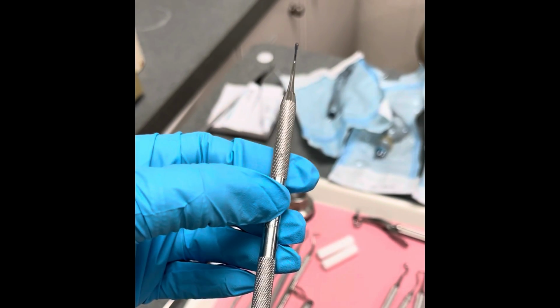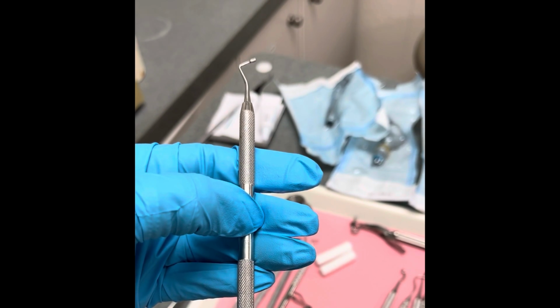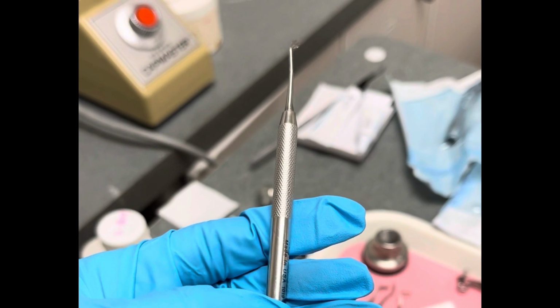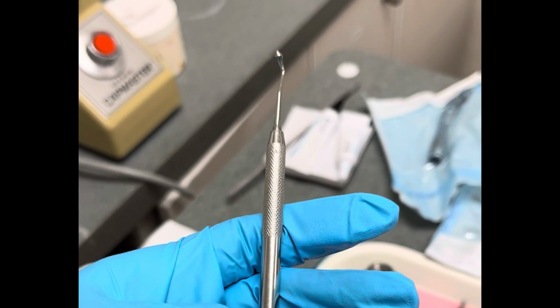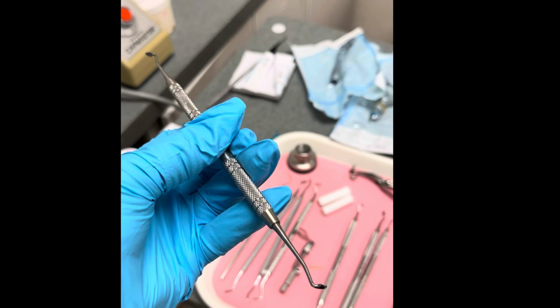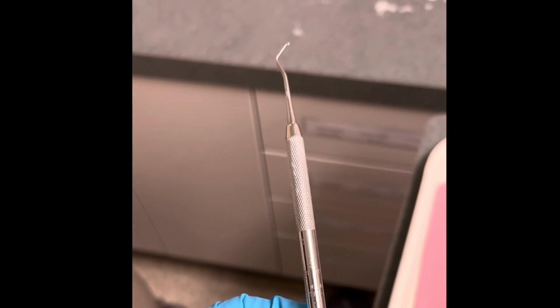This is the first tool you're going to give the doctor. It's a condenser. It's going to make sure all the amalgam is condensed to the tooth. The doctor will then use an acorn burnisher to carve any anatomy onto the tooth. Cleoid discoid removes any excess restoration material around the tooth. You will use a spoon excavator to remove any debris from the tooth.